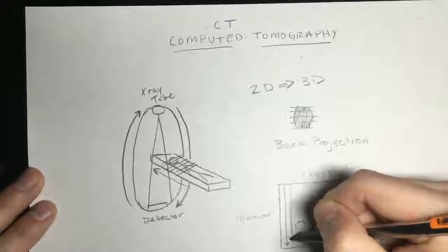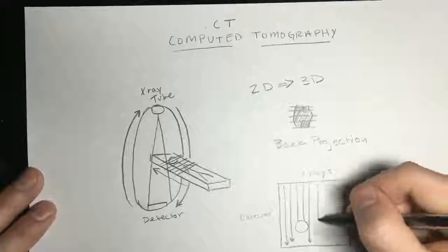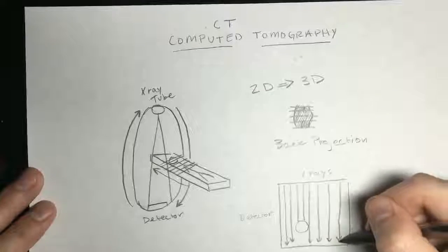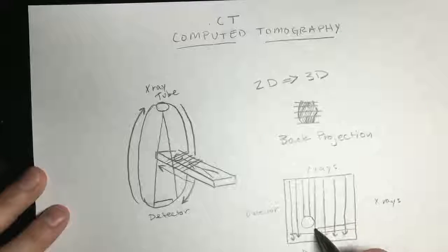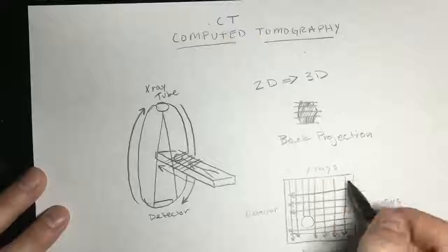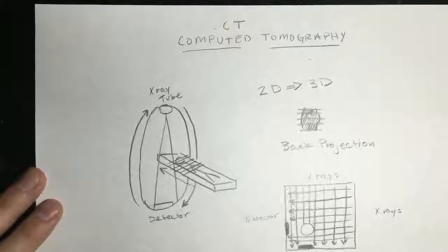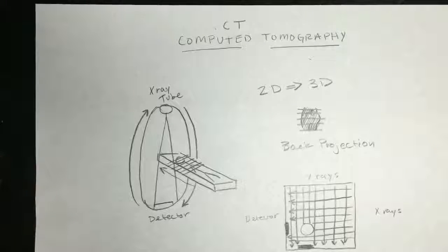So this is a brief and small diagram of back projection where the X-ray sources are from the top and from the right, and the detectors are obviously on the other side. And you can see that there is an area in the diagram where the detector does not receive some light. And again, this is how the CT takes data and images and things of that nature.